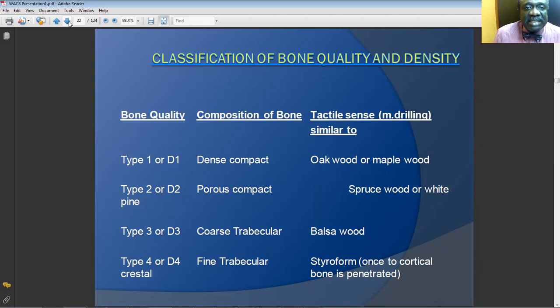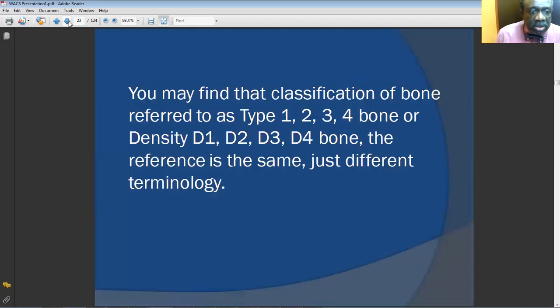And a very sexy lady with very nice long nails can use the nails to drill into the posterior maxilla if we're not careful.